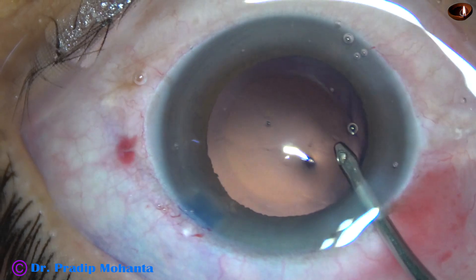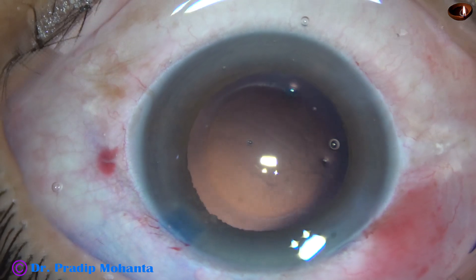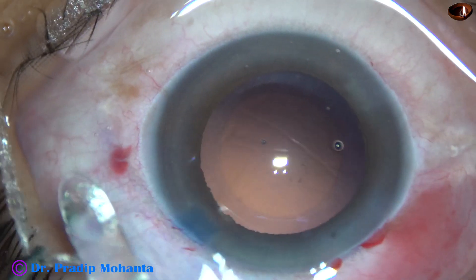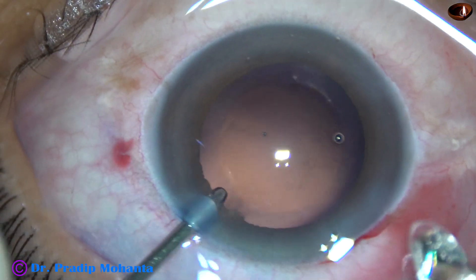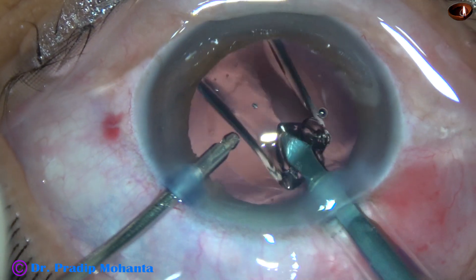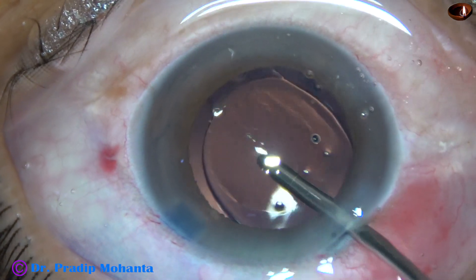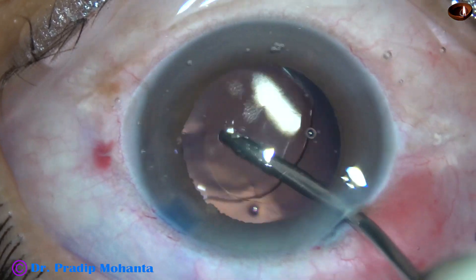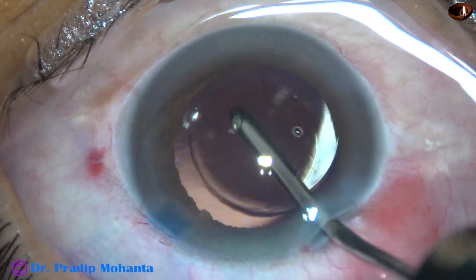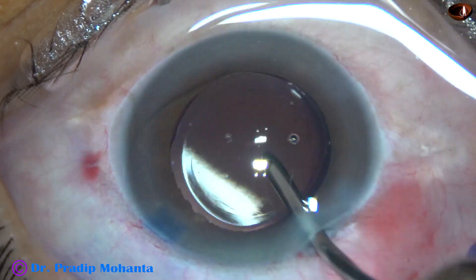This is hydropolish. After hydropolishing, implantation of a single-piece monofocal intraocular lens is done. The lens goes into the capsular bag and is dialed by the irrigating probe. Whatever viscoelastic was present in the cartridge has come out by irrigation.